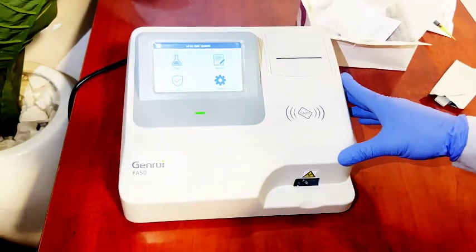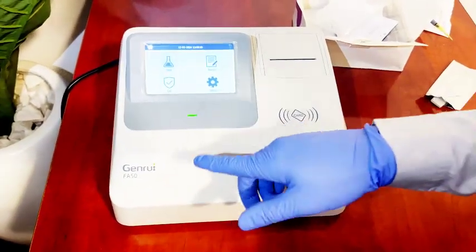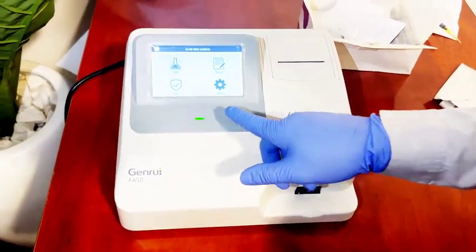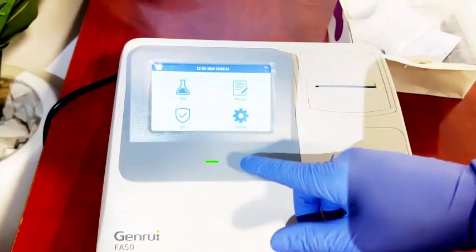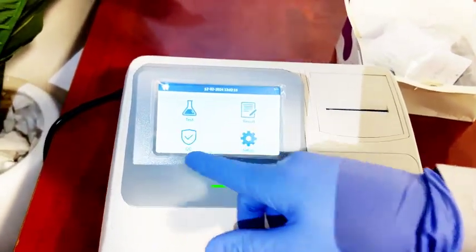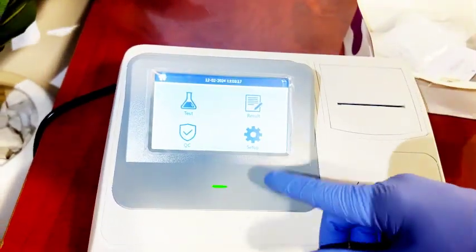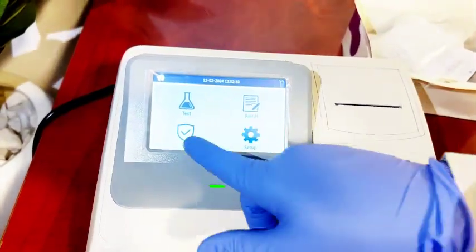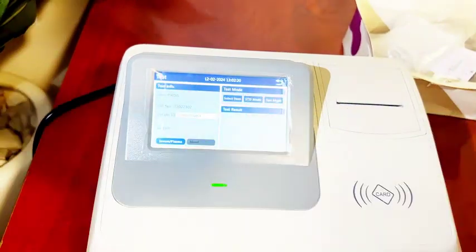So we are about to start the test. We have four parameters here: Test, Result, QC, and Setup. Since we are running a test, you click on Test.